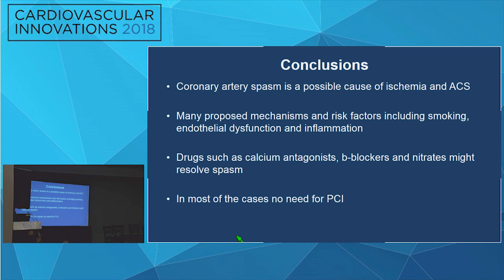Focal spasm, would you guys ever stent for refractory medical therapy? Would you ever stent focal spasm that's recurrent? No, I think it would be both actually. Spasm somewhere else. Yeah. But I think there are certain circumstances where people think it's a stenosis and they've stented it, and then after the fact they realize they just stented spasm. So it's important to give a nitroglycerin. Exactly. Always give nitro if you can.